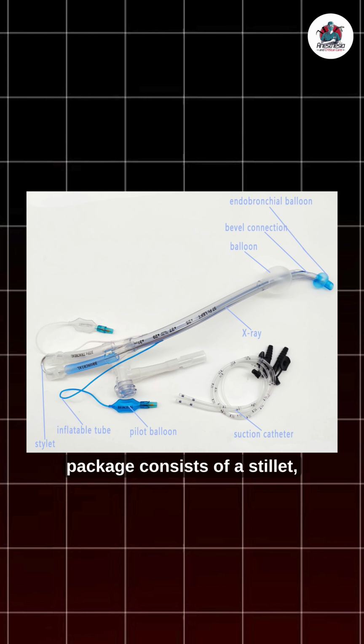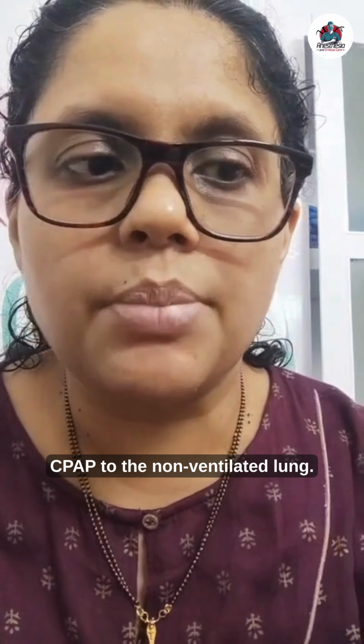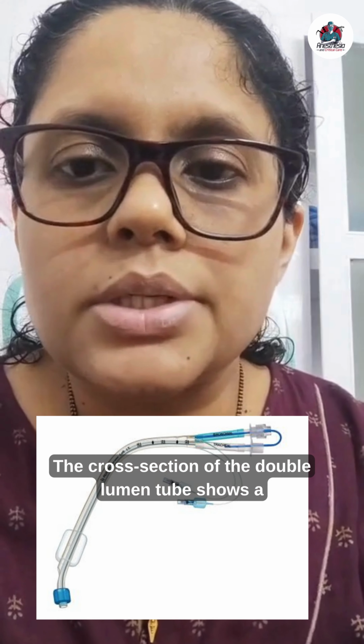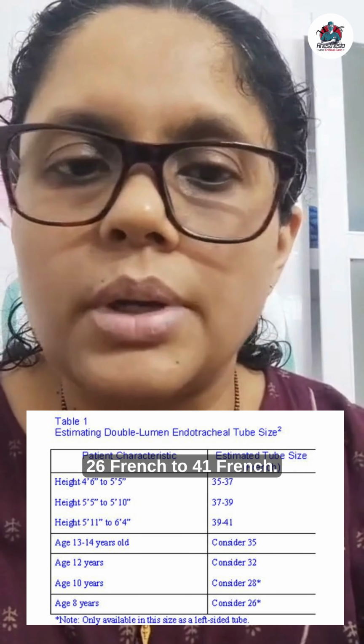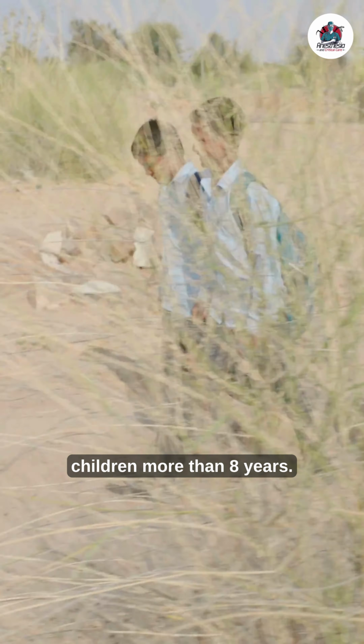The double lumen tube package consists of a stylet, a connector and suction catheters. Some may provide an apparatus to provide CPAP to the non-ventilated lung. The cross-section of the double lumen tube shows a D shape. Sizes range from 26 French to 41 French. 26 French is usually used for children more than 8 years.